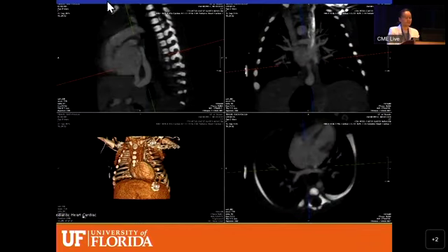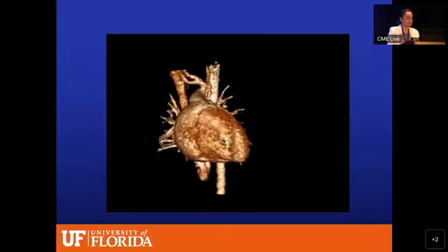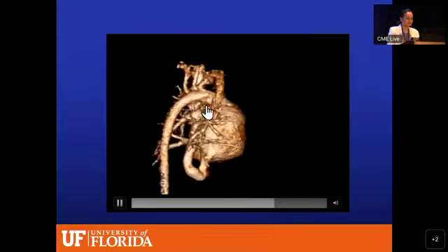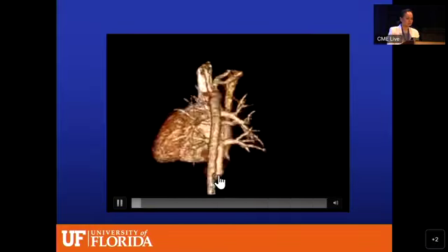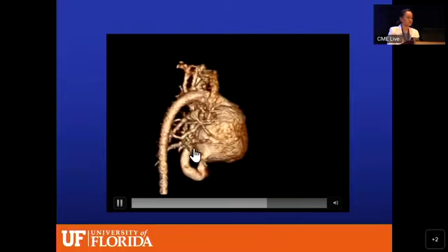Again, the other advantage of multimodality, cross-sectional imaging, is you could do multiplanar imaging, and this could help your surgeon with preoperative planning. Again, this is just a nicer view of that total anomalous pulmonary venous return with the vertical vein draining to the IVC here.